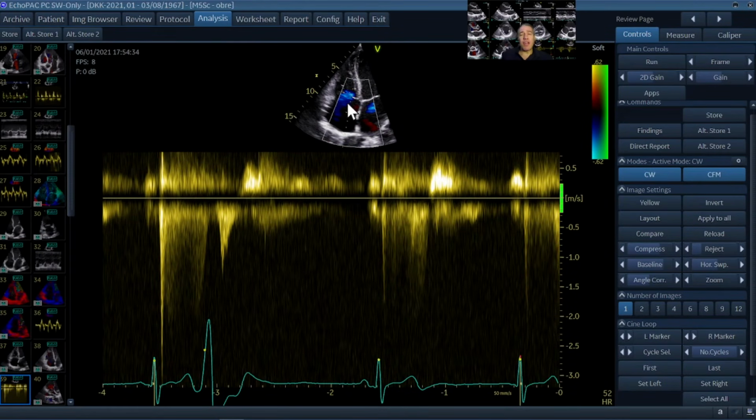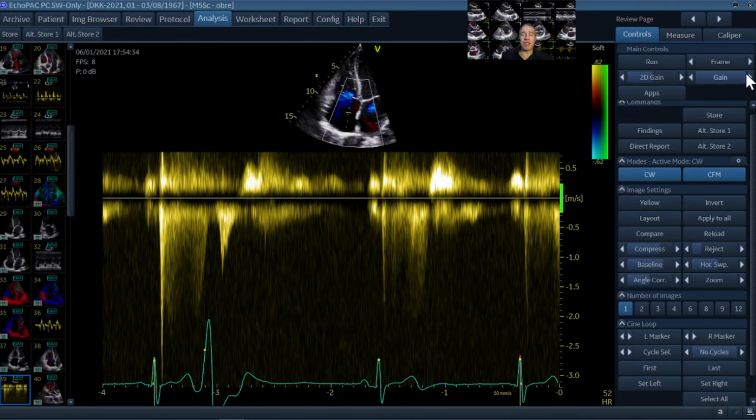I tried here to put a continuous wave Doppler probe across the tricuspid valve. In the previous color Doppler, you saw that there was not any significant regurgitation across the valve, and that also is seen here in the Doppler spectrum. There is some signal here during systole, and here also. We can move on frame by frame also. So there is some signal, but it's very hard to detect where this ends, and the velocities where it's clearly seen are quite low.